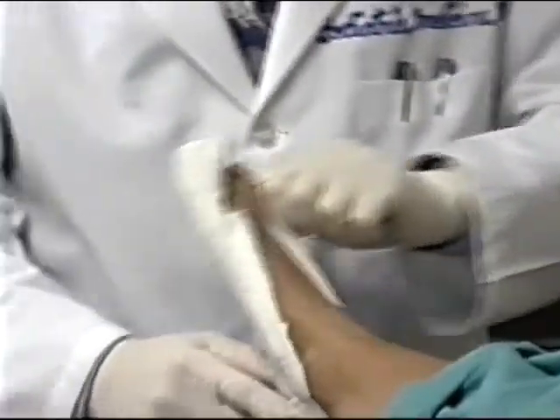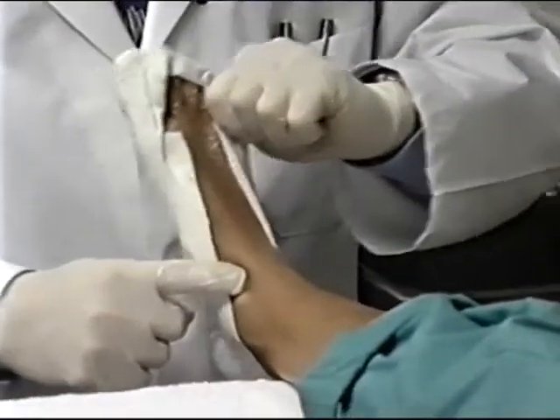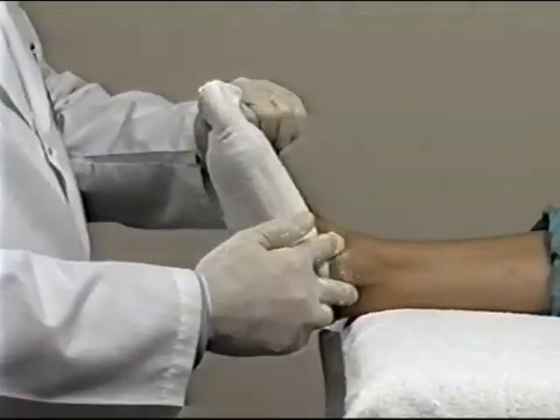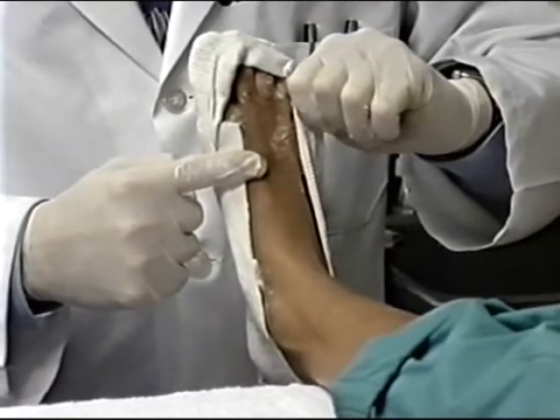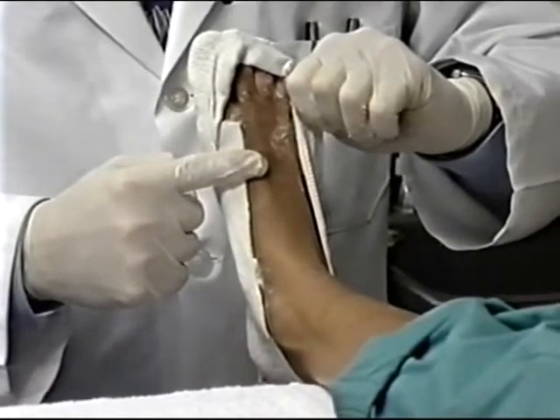Position the foot by pinching the fourth and fifth toes, making sure not to dorsiflex or plantar flex them. Place the subtalar joint in its neutral position, while the forefoot is dorsiflexed on the rear foot and the medial column of the foot is slightly plantar flexed. Hold this position until the plaster gets hard, which takes approximately three to five minutes.